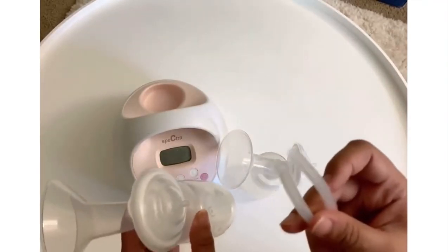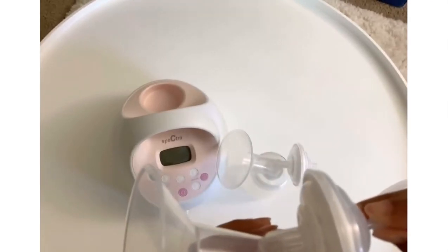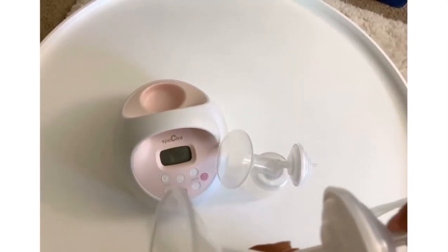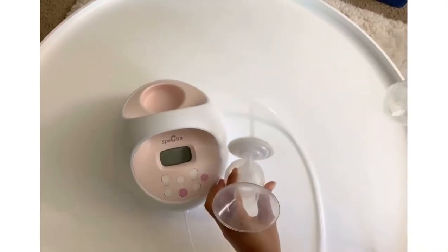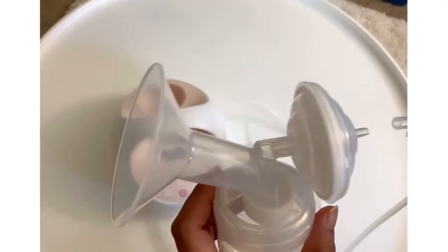And now I am going to connect the hose to the tubing port. You just have to do the same with the other one.